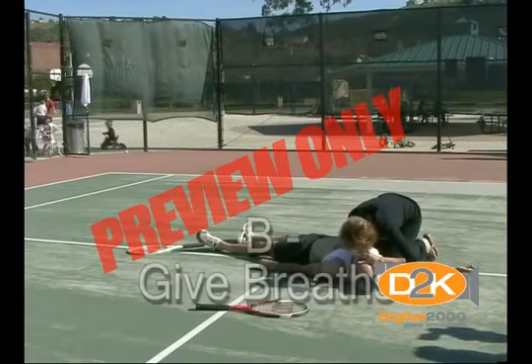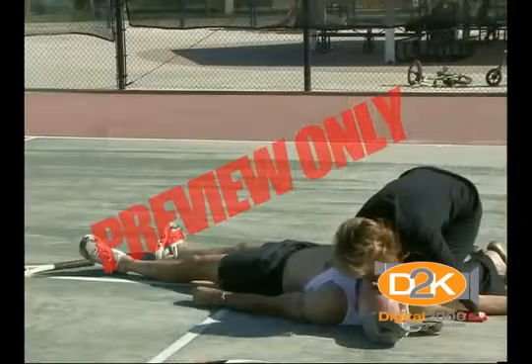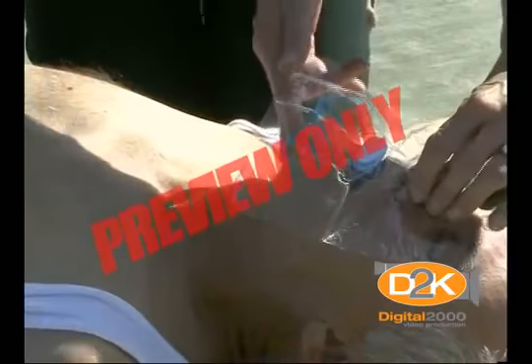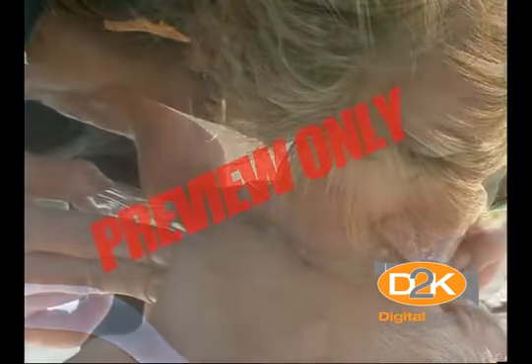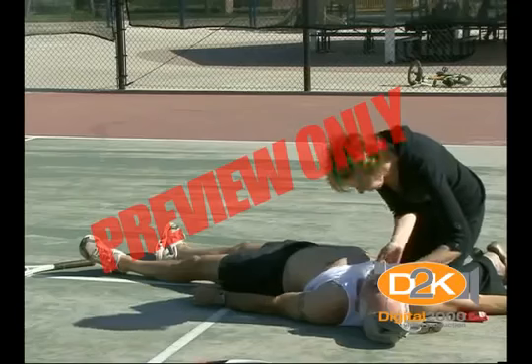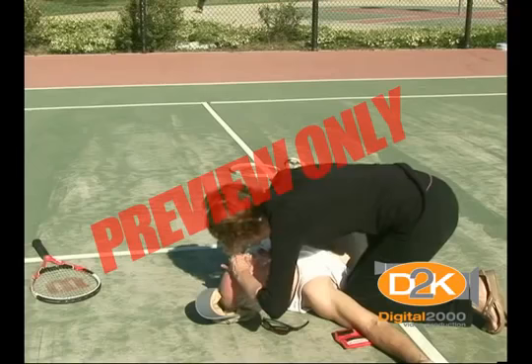Give breaths. Administer 2 full breaths. Each breath should be no longer than 1 second each. With their airway completely opened, place a CPR mask barrier over the patient's mouth. Next, pinch their nose using your hand that is on their forehead and place your mouth over their mouth, making sure you have a tight seal so no air escapes from the sides. While lifting up on the chin, give 1 breath. Take your mouth off, take a breath, and then give a second breath.